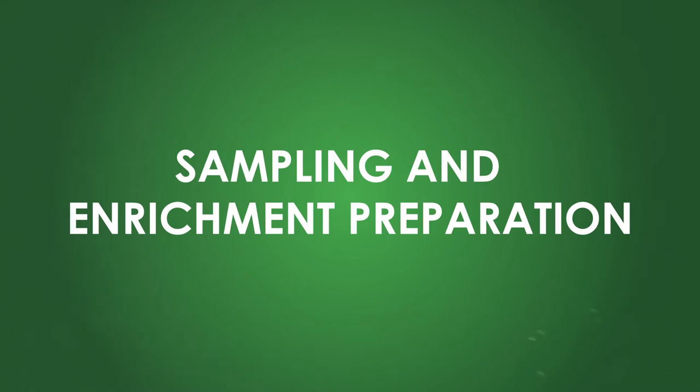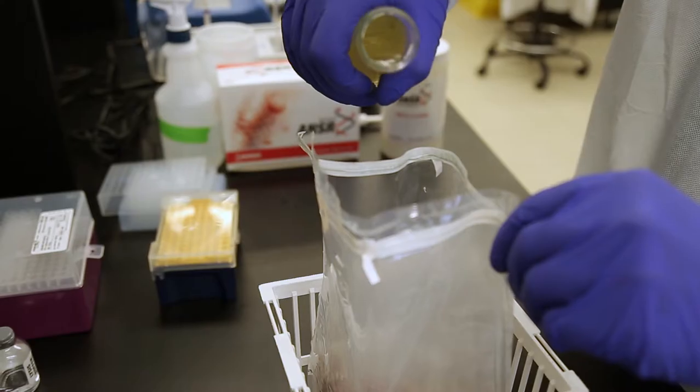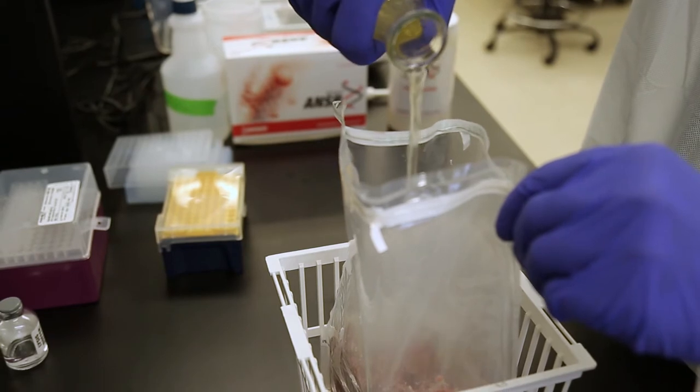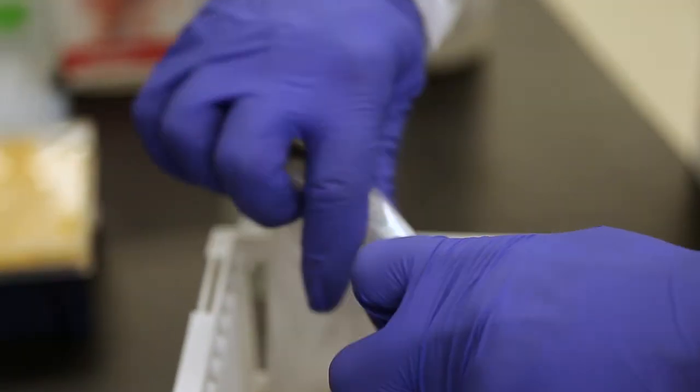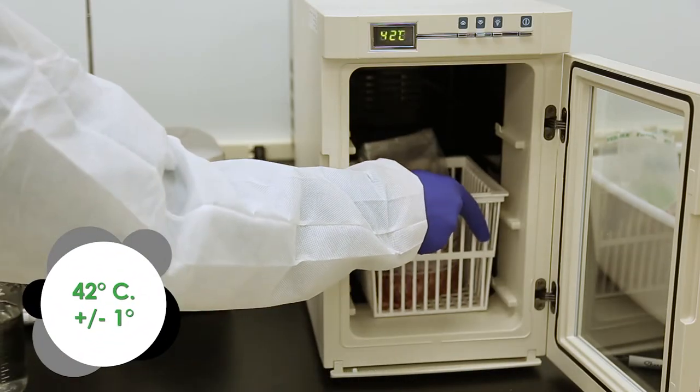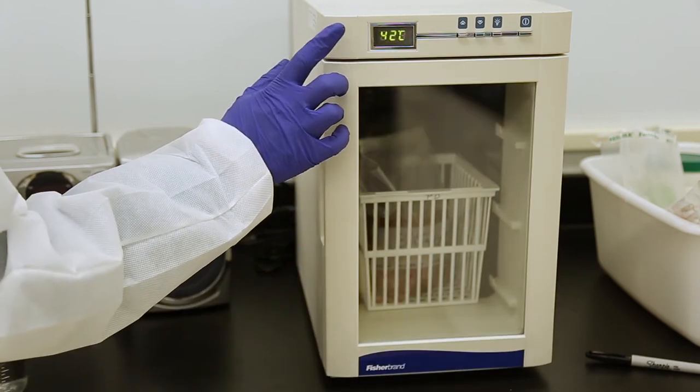Sampling and Enrichment Preparation. This video demonstrates the procedure using raw ground beef and environmental samples with Neogen's Answer for E. Coli Enrichment broth media. Weigh out the appropriate amount of sample and rehydrated media into a sterile stomacher bag as seen in the chart. Close up the stomacher bag as shown and incubate at 42 degrees Celsius plus or minus one degree for the amount of time listed in the kit insert.